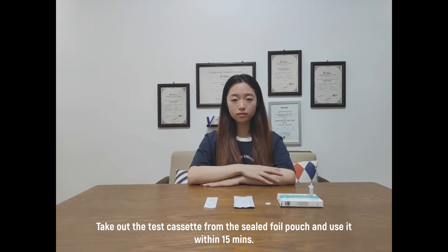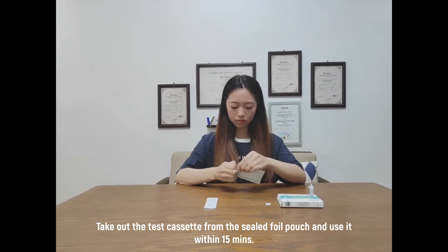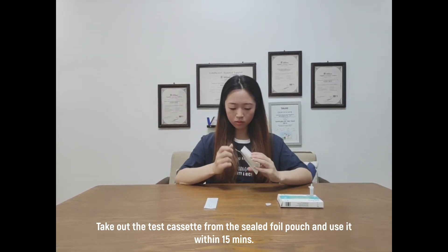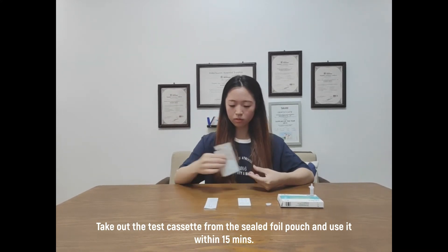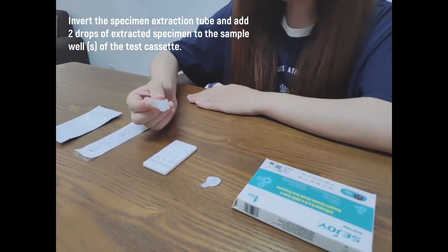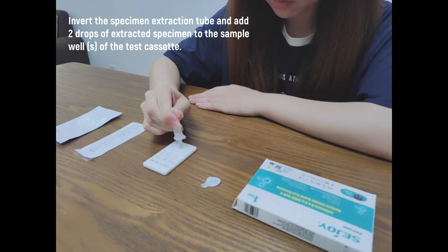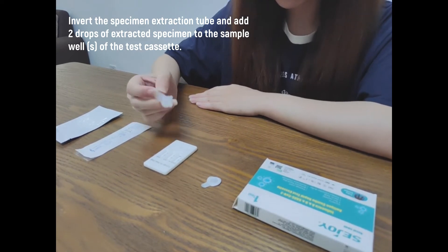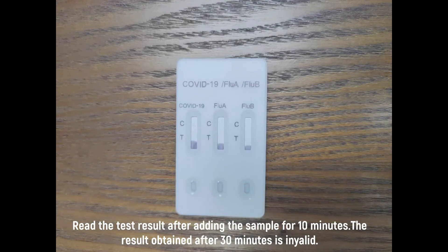Take out the test cassette from the sealed foil pouch and use it within 15 minutes. Invert the specimen extraction tube and add two drops of extracted specimen to the sample well of the test cassette. Read the test result after 10 minutes. Any result obtained after 30 minutes is invalid.